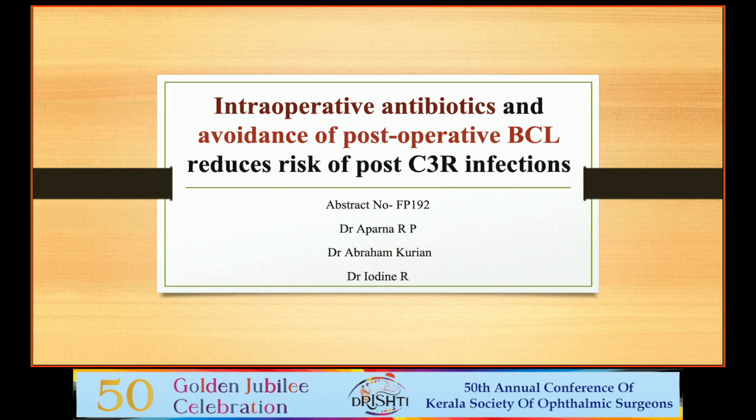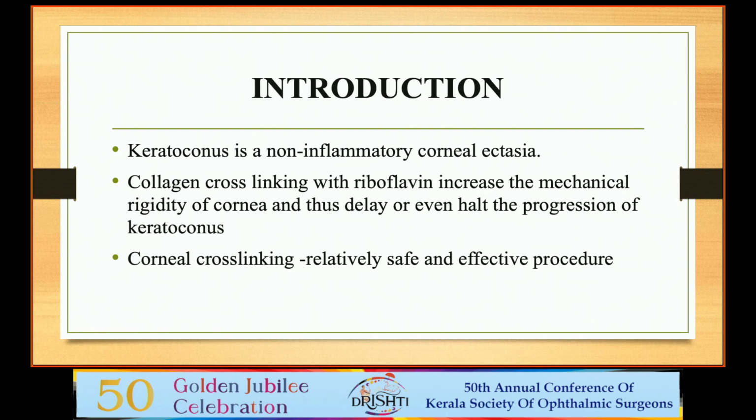Good afternoon. My topic is intraoperative topical antibiotics and avoidance of postoperative BCL reduces the risk of post-C3R infection. Keratoconus is a non-inflammatory corneal ectasia, and collagen cross-linking is a treatment of keratoconus, which increases the mechanical rigidity of the cornea and thus delays or even halts the progression of keratoconus.